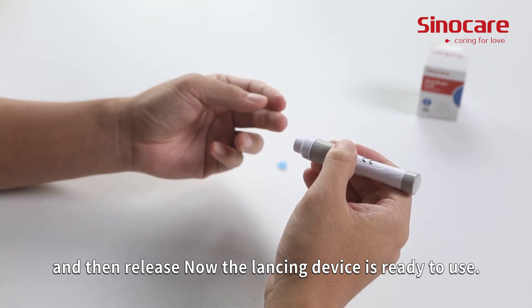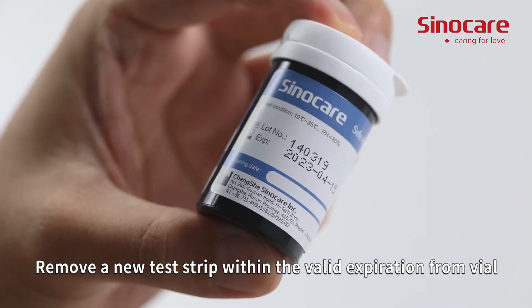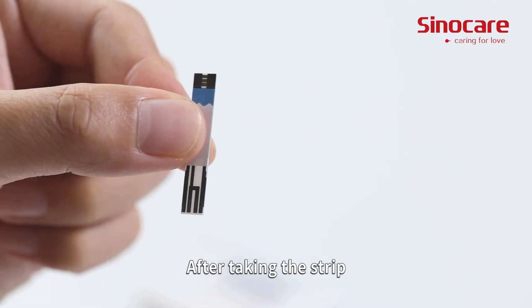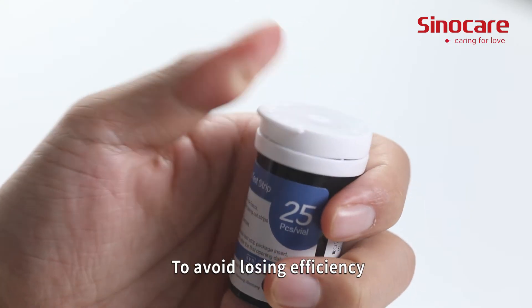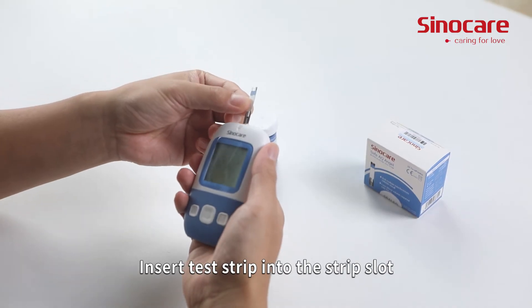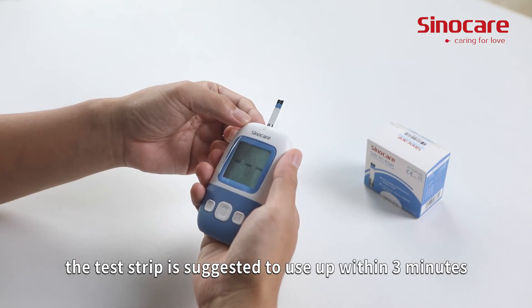Now the lancing device is ready to use. Remove a new test strip with a valid expiration date from the vial. After taking the strip, immediately cover the vial to avoid losing efficiency. Insert the test strip into the strip slot. The test strip should be used within three minutes.